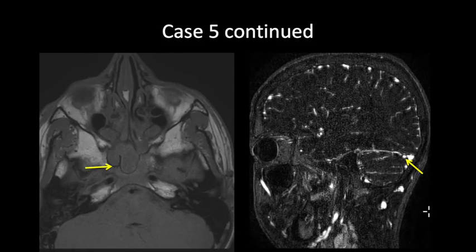Within the same case as well, we can also see that there's that abnormal signal within the clivus indicating a skull-base osteomyelitis. And on the MRV, we see lack of filling of that right transverse sinus, which does confirm extension along and further dural venous sinus thrombosis.